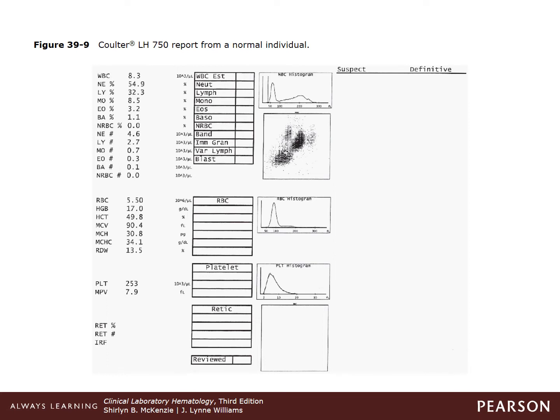The first aliquot is delivered to the red blood cell platelet dilution chamber. Here the red cells are diluted with an electrically conductive diluent. Within the chamber there are 3 separate apertures, each with an internal electrode. As the cells pass through the aperture, there's increased resistance, which is the pulse height, between the external and internal electrodes that's proportional to the cell volume. There's always a steady stream of diluent, so the cells are prevented from re-entering the aperture; it flows them out so they're not counted again.